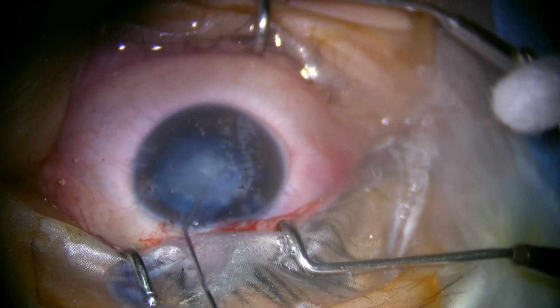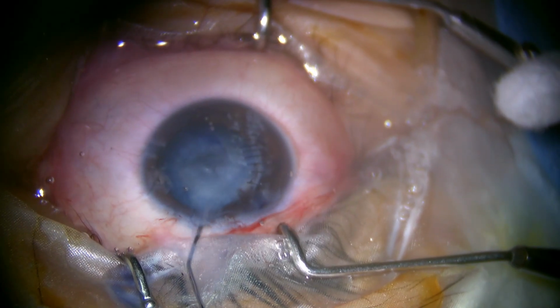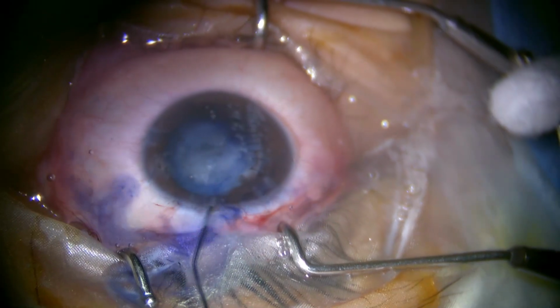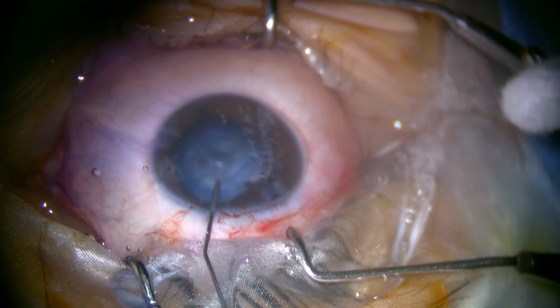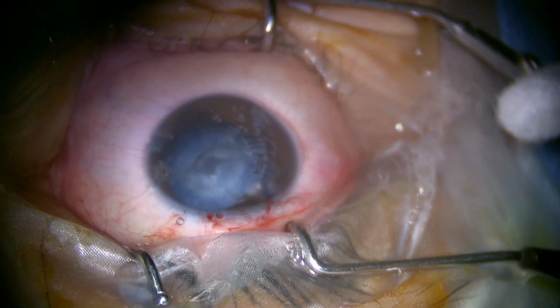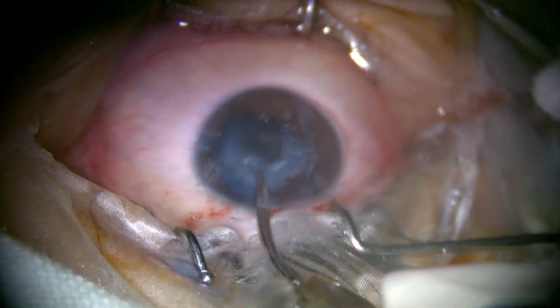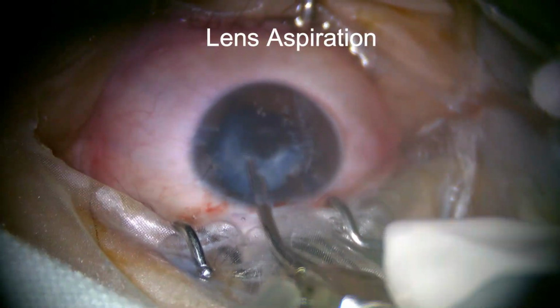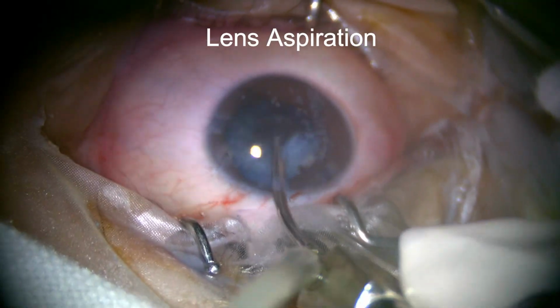Kindly note the steps of lens aspiration of traumatic cataract which are depicted in this video one by one. Limited hydrodissection was done because we were not sure of posterior capsular integrity in traumatic cataract. Since the child was of 12 years of age and there was no nucleus present, the lens aspiration was done by Simcoe cannula.